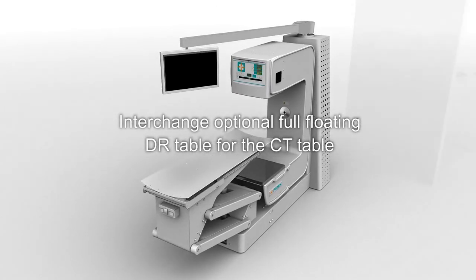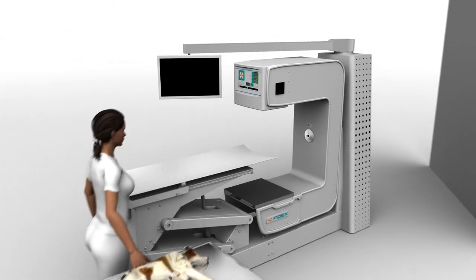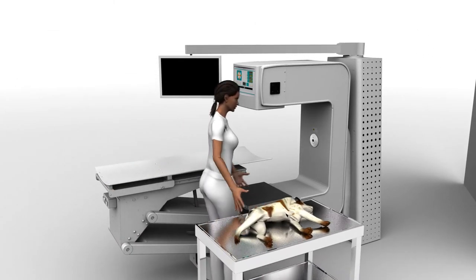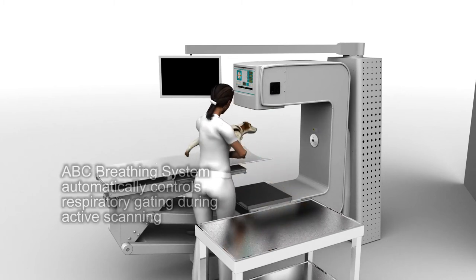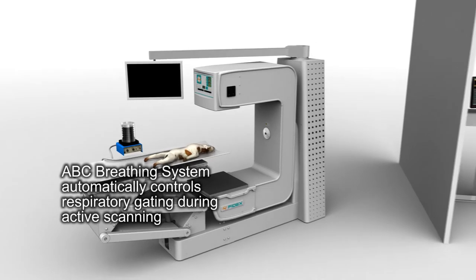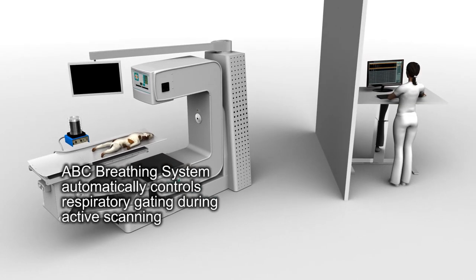Next, place the patient on the table and connect the patent-pending Animoj Automatic Breath Control System to the patient. This system automatically controls respiratory gating during active scanning, thereby preventing study motion artifacts.